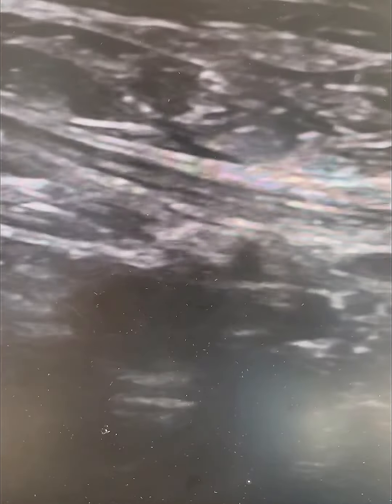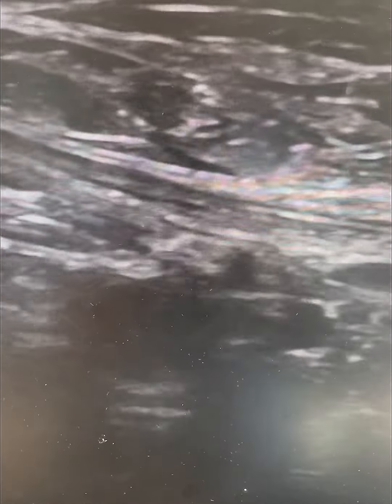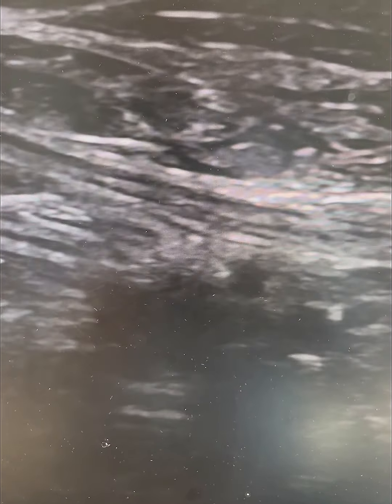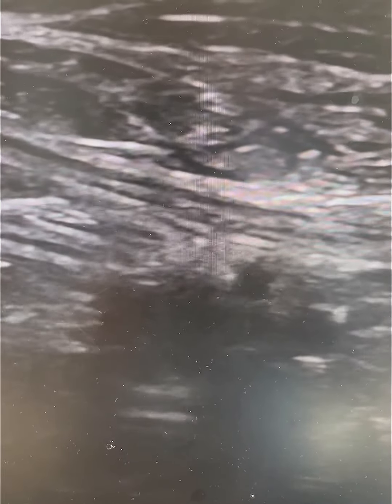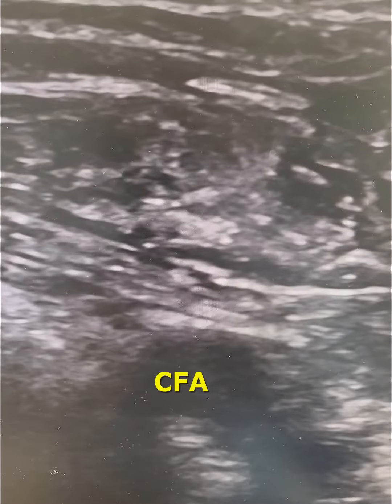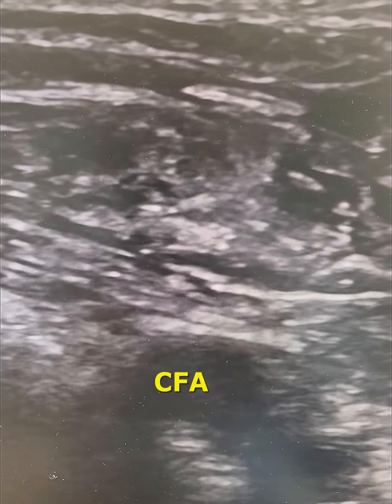This is Lichaa, interventional cardiovascular specialist, coming to you with a quick video on the importance of identification of the inguinal ligament by ultrasound to avoid high sticks in common femoral artery ultrasound guided access. As you see here, the operator is sweeping the groin up north towards the external iliac artery, identifying the common femoral artery first, and then sweeping to the external iliac artery.